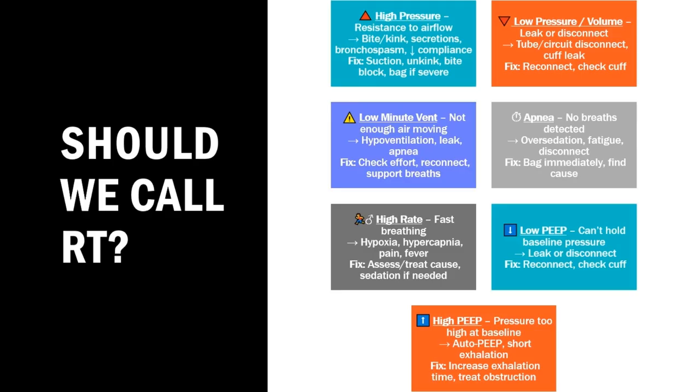These are the big bad ones we learned about in school. They talk about the tracheal deviation and all that. Tracheal deviation is a late sign. If you wait to find that, your patient will be dead before you notice it. We need to find these quick and early. You'll have an absence of air moving on one side, a decrease in blood pressure, and an increased work of breathing. If you have persistent high pressure alarms after you've gone through your DOPE mnemonic, really be thinking about pneumothoraxes.